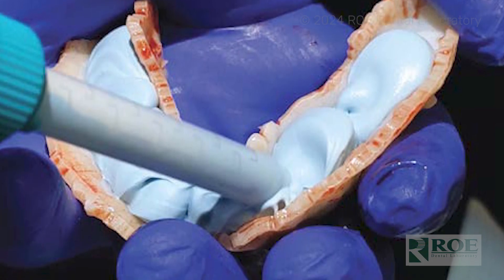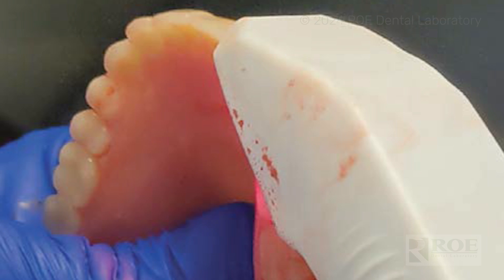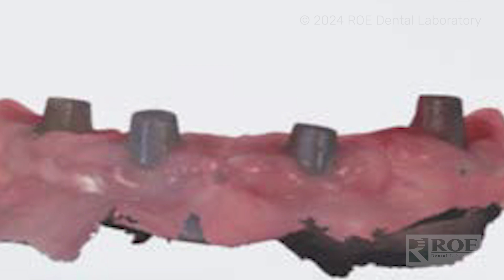Get the ideal bite and vertical, then let that set. From there, scan the opposing, scan the denture itself, and then scan the bite. Next, remove that denture and give us a 360-degree scan of that denture — now we have the implant positions captured in the intaglio of that reline denture.